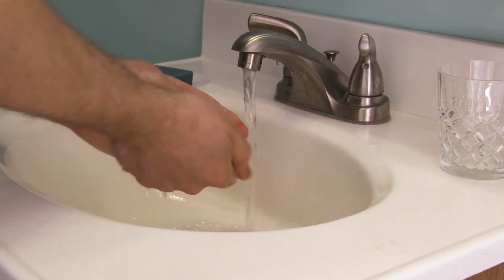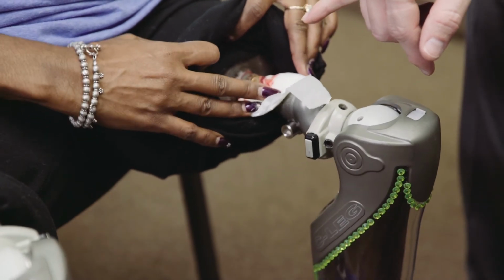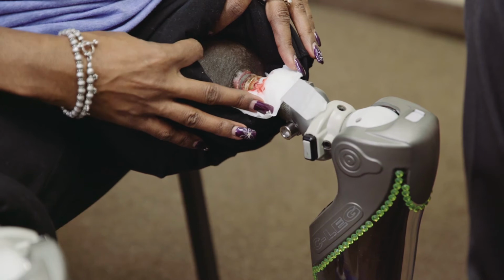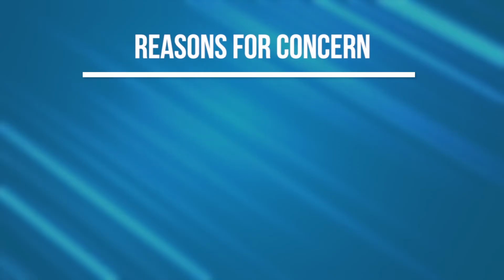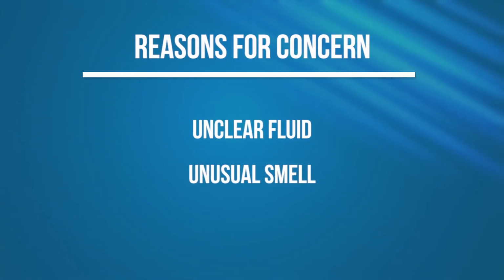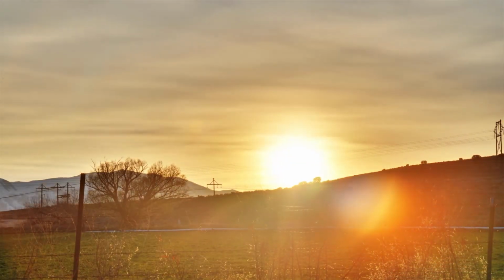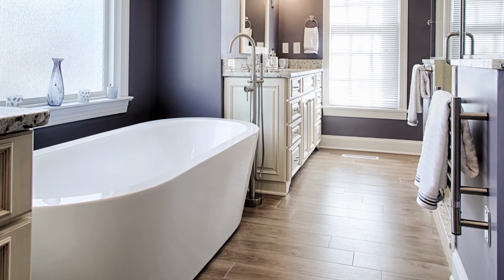For the first several months after surgery, and perhaps even longer, there will be some fluid discharge from the opening. This is completely normal. If the fluid is excessive, nursing pads can be used to help prevent the fluid from staining clothes. If the fluid is not clear or contains excessive amounts of blood or has an unusual smell, please contact your osseointegration liaison or a physician. Other steps that help promote a healthy limb are exposure to sunlight, Epsom salt baths, and generally keeping the area clean.